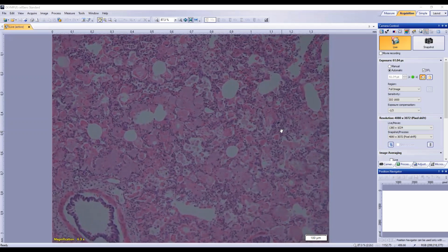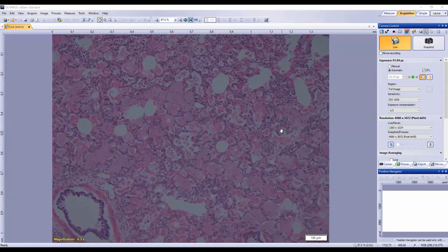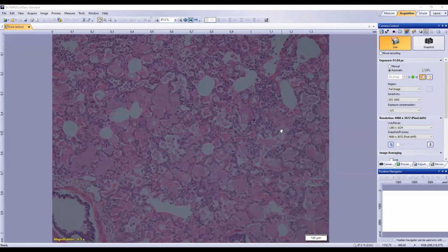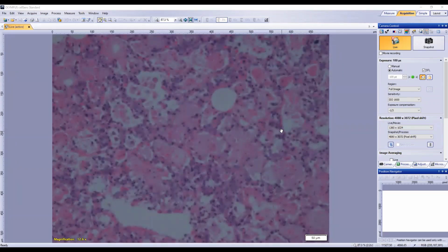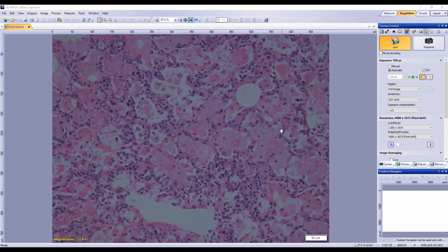I would say this continuous lining would be cuboidal kind of cells. So do we have type 2 pneumocyte hyperplasia through here? I would say so. Can we identify that specifically? Because it can be really hard with a lung like this when there's just so much going on. According to Job and Kennedy, it's not possible under H&E to differentiate pneumocyte 2 and the macrophages. I would really struggle to do that in a lung that looks like this. But do you see my cursor?